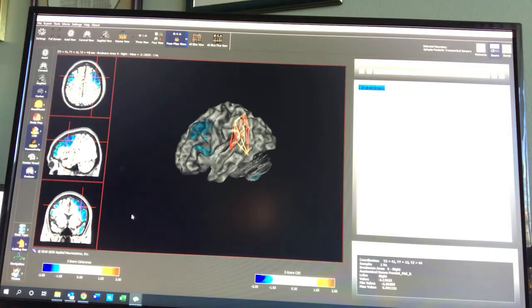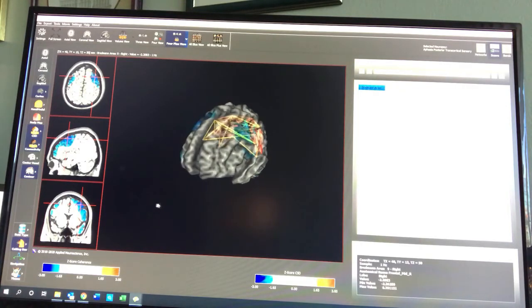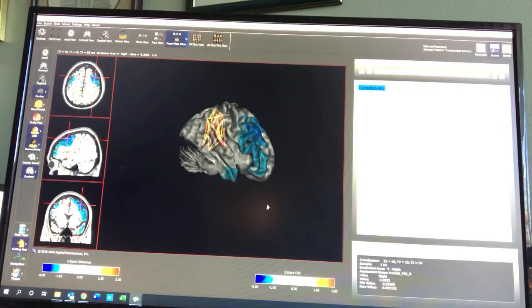And so what we're looking at in the blue in this image, and this is a low resolution brain electromagnetic tomography map, or LORETA, on the left, we can zero in and see different slices of the brain when we're looking at the image. When we look at the image in the middle, we're looking at the brain with the area described in blue, meaning the deepest abnormality of the 1 hertz frequency that we can see on the surface of the brain, that's showing up also in these LORETA images on the left.